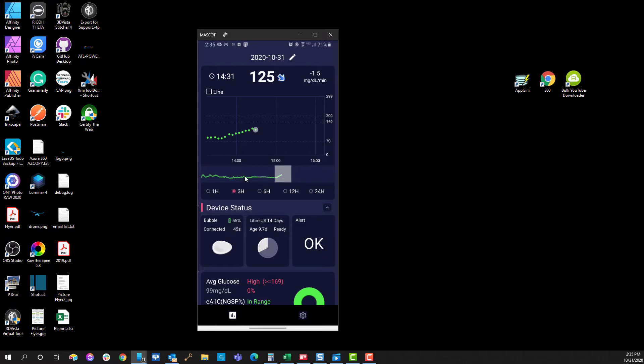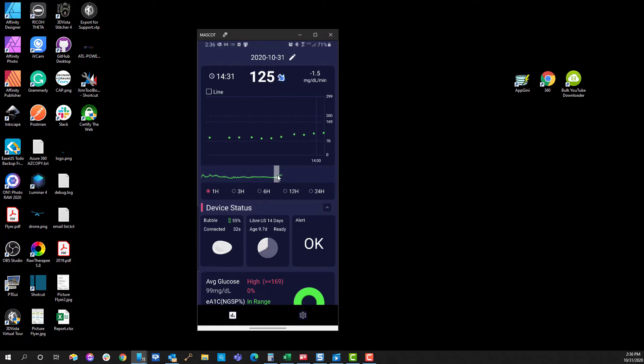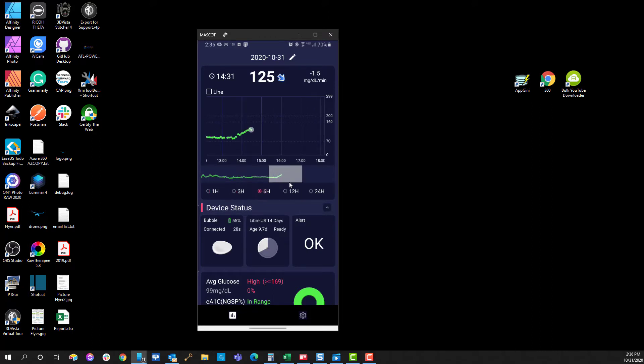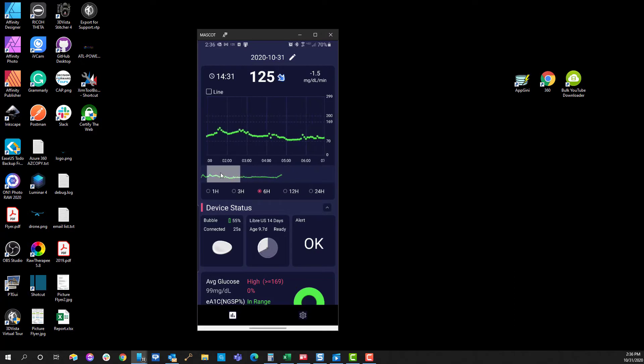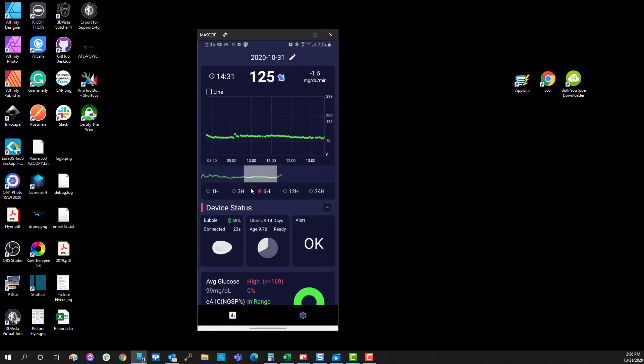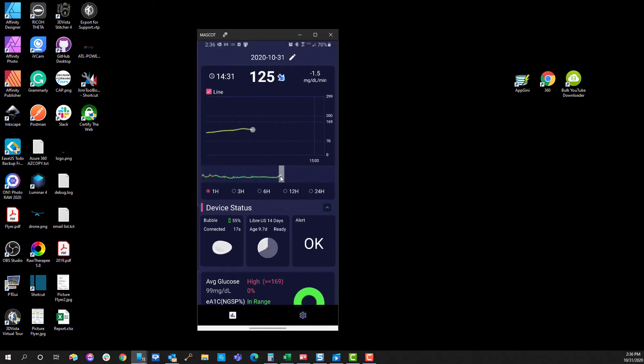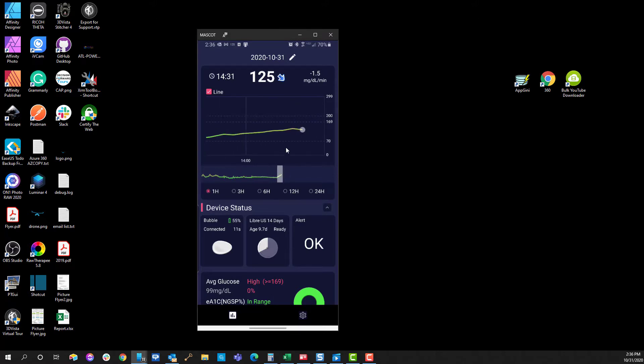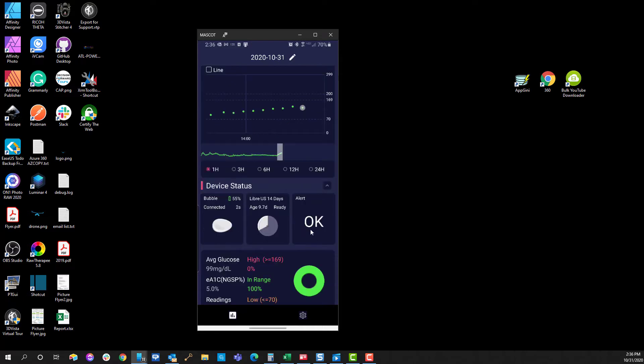This will be the next interval—this is what happens every five minutes. I'll get a reading. It will verbally now tell me because I've set that on. I can also look at a tighter view of the data. This is within one hour. I'm zoomed in within a one-hour area. I can also zoom out to three hours, six hours, twelve hours. I can use this as a timeline scroller to get around. If I don't want to see the little dots, maybe I want to see more of a clear trend line analysis. That will help out. It'll change colors from green to, as I'm getting higher, I'm getting into a warning area because the sugars on the rise.